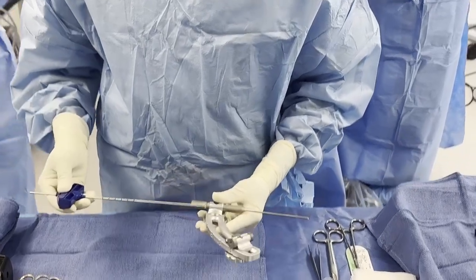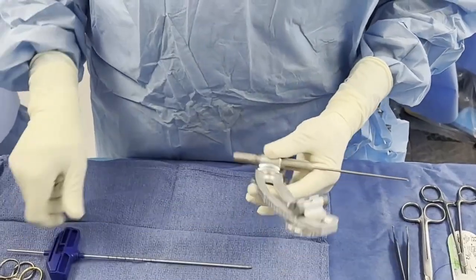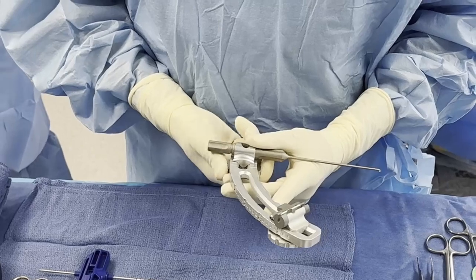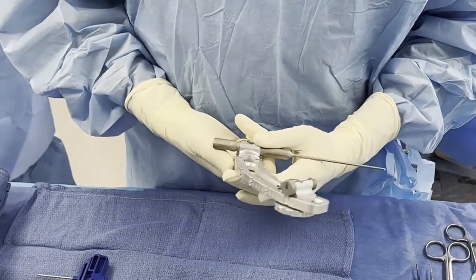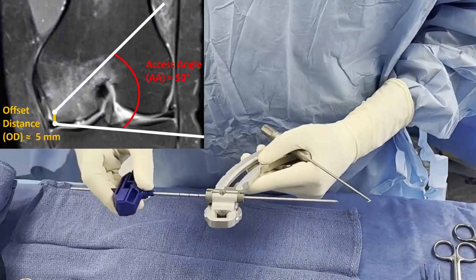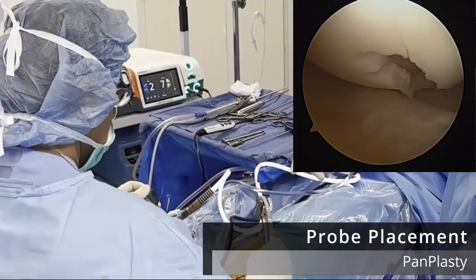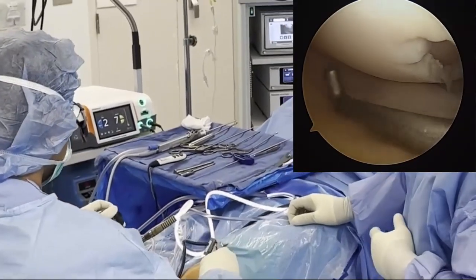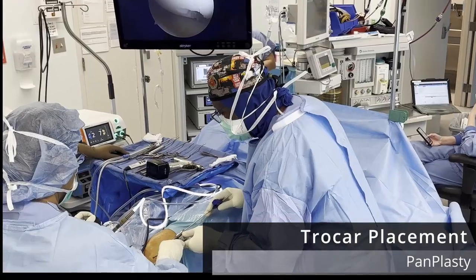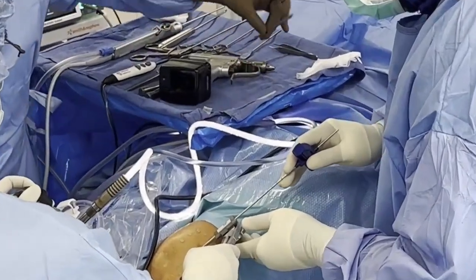The Panplasty guide is now adjusted on the back table. It consists of the frame, delivery cannula, and localizing probe, and the respective housings. The housing for the localizing probe can be translated linearly, while the one for the delivery cannula can be translated in an arcuate fashion. The offset distance and access angle are set per the preoperative template. The localizer probe attached to the preset guide is then placed on the arthroscopic reference point, generally through the contralateral portal. The delivery cannula is then passed through its housing to indent the skin at the provisional entry site.